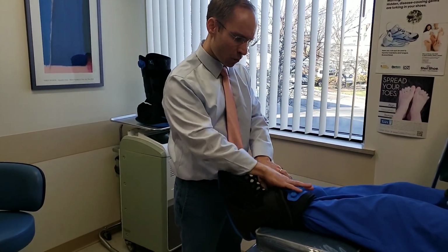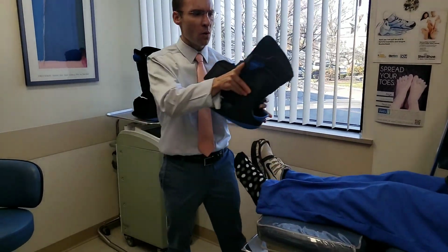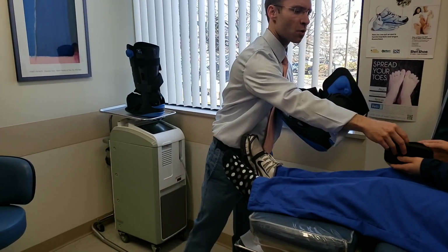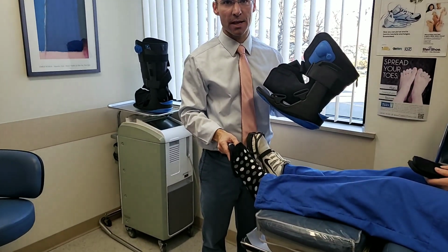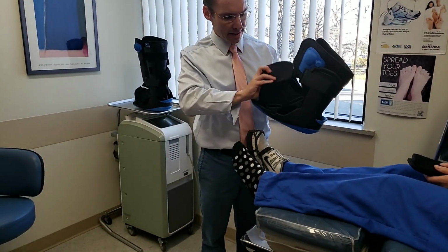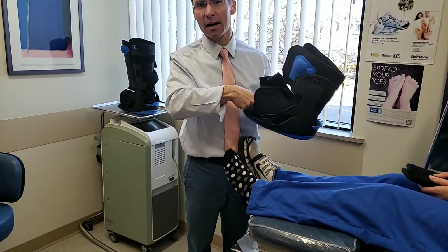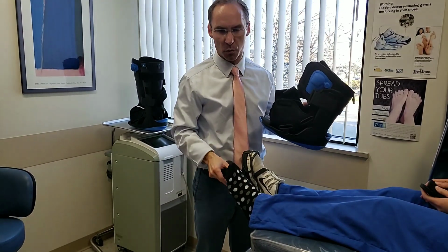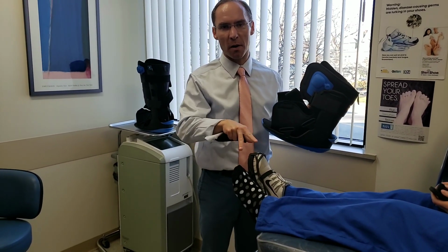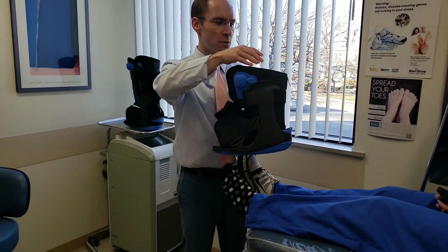So one thing you have to realize about these pads: let's say you had a sore on your foot, you're not going to add padding underneath where the sore is. You do actually the opposite. You have to add some padding in here. We usually use felted foam, and then you cut out an area where that ulcer is, and you put the felt with a cutout where the wound is, and then you can add some foam on top of it to take the pressure off of it. So that's what this boot is used for.